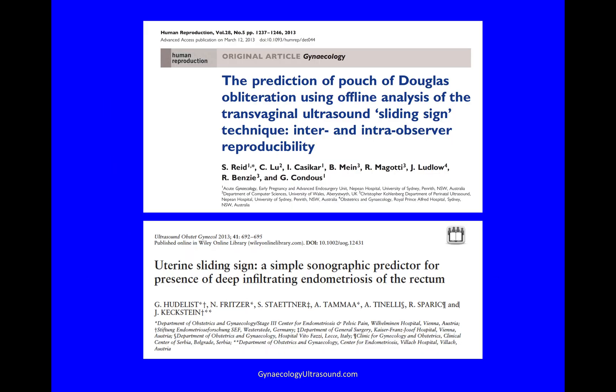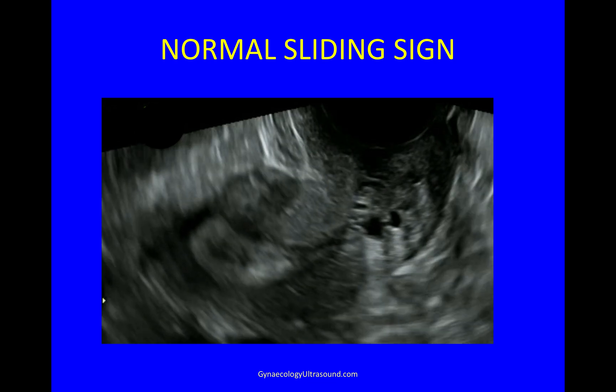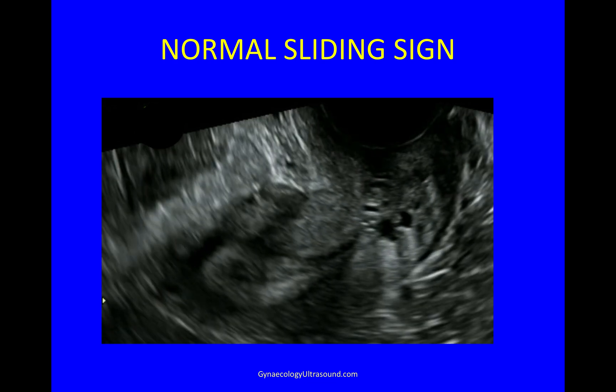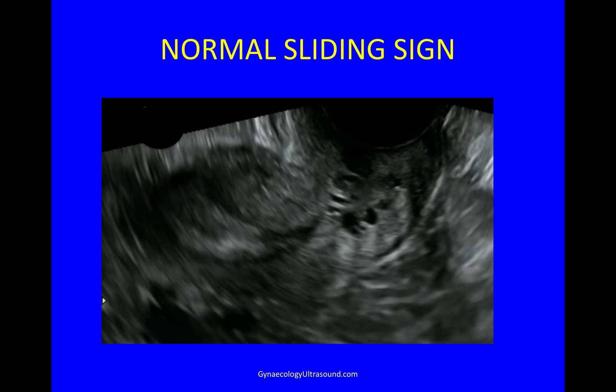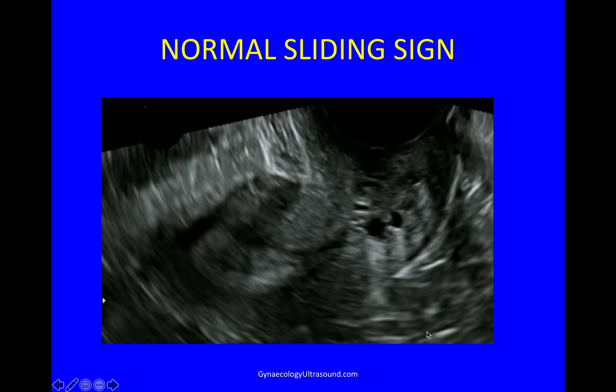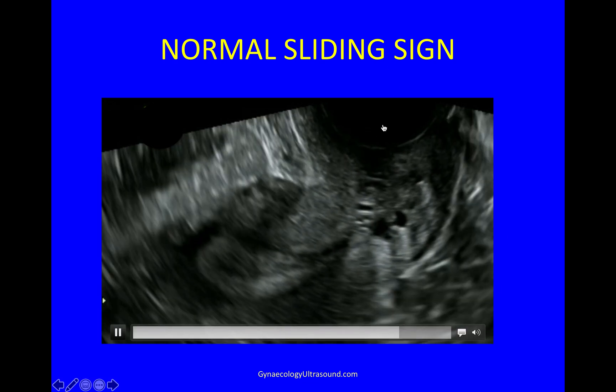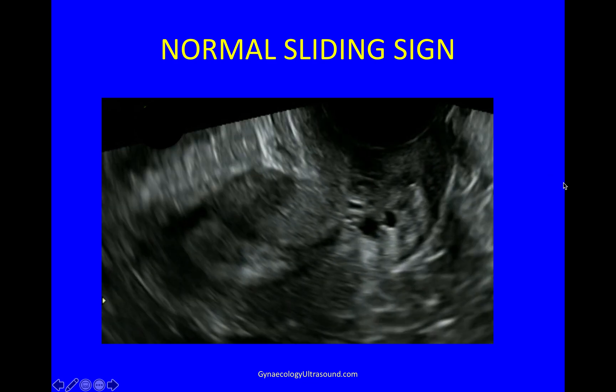The sliding sign should be part of every systematic routine gynae scan. This paper from 2013 described the sliding sign for the first time. This is a normal sliding sign, where the uterus moves one way, and the bowel behind it moves in the opposite way, when you very gently press your probe against the cervix.